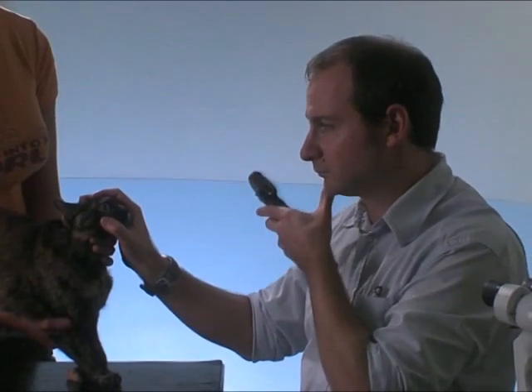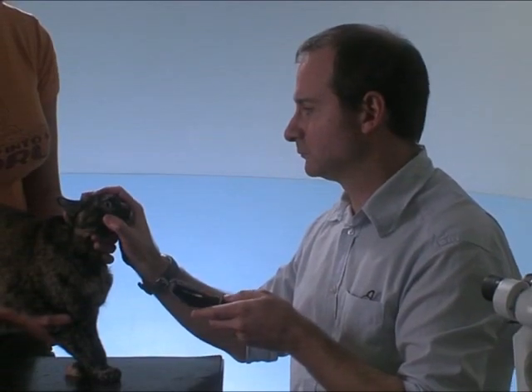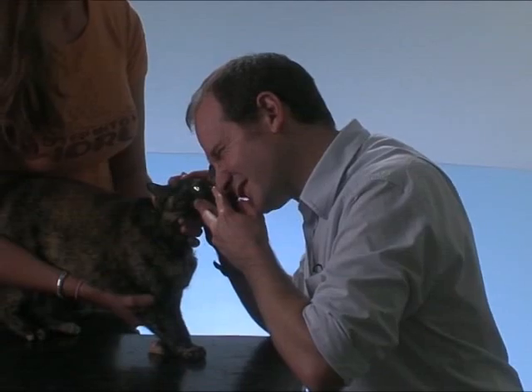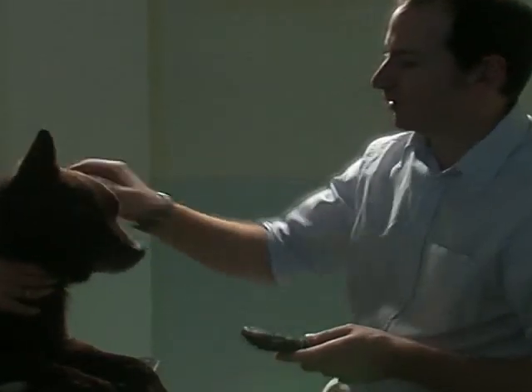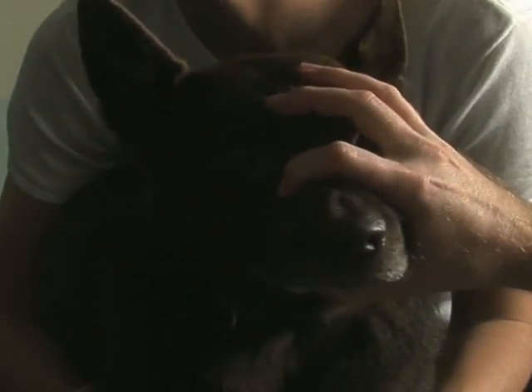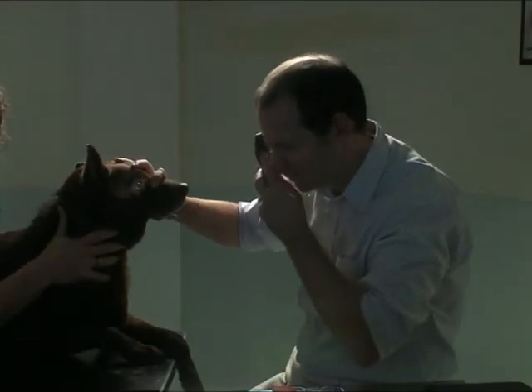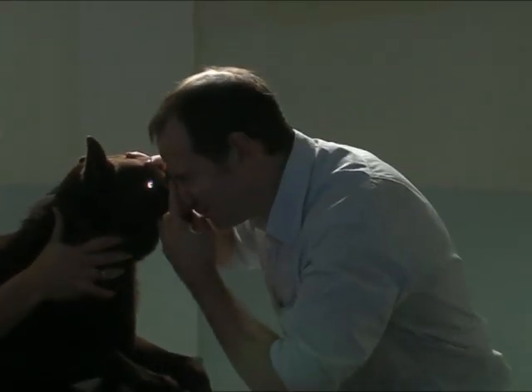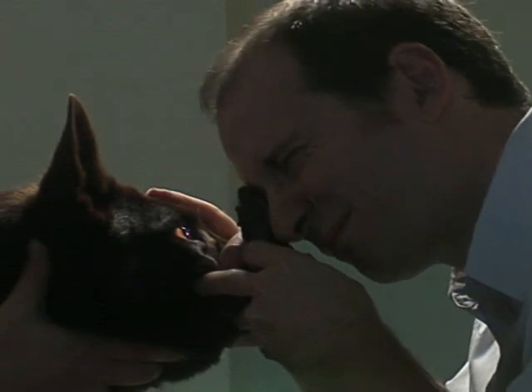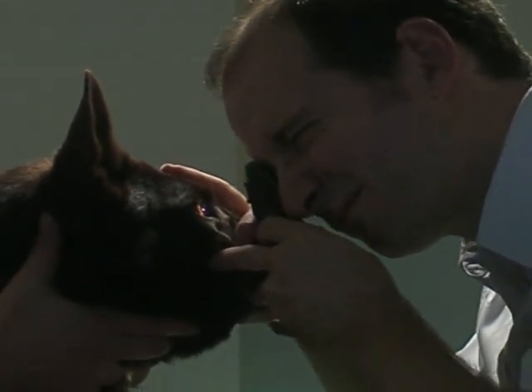The ophthalmoscope is placed close to the animal's eye, then the examiner approaches the instrument. Alternatively, the examiner can move in from the distant viewing position. As you come into the animal, you need to be probably 1 or 2 inches away. You really want the fundus to fill your view. You don't want to be getting pupil and eyelids in that image, so that you can concentrate on the fundus.